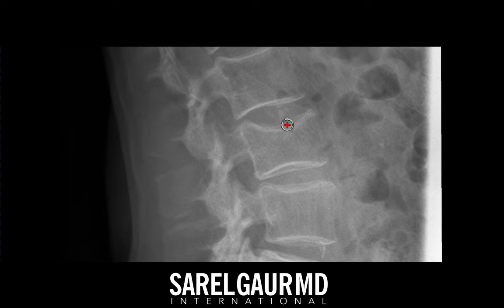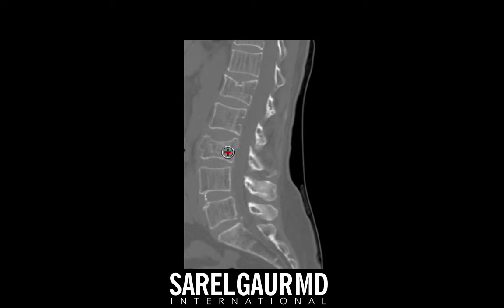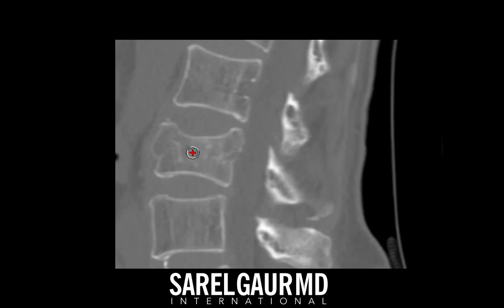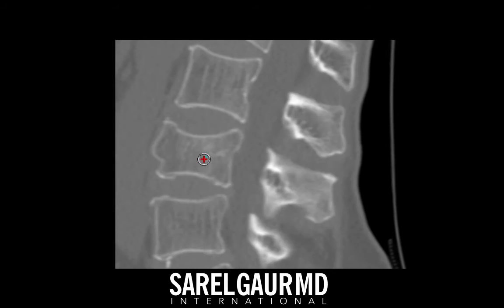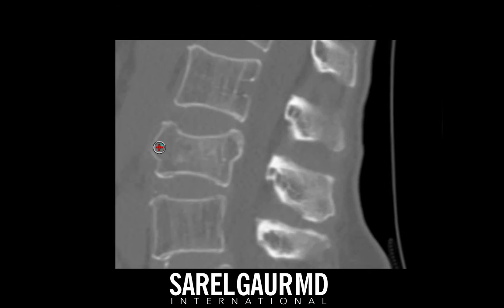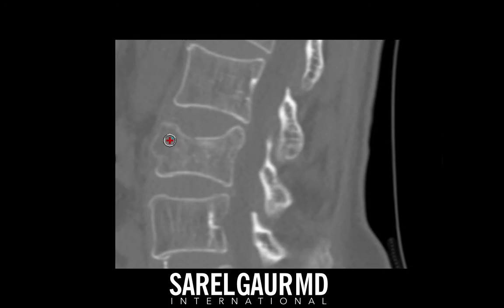The next step is to get a CT or MRI to confirm this finding. Now I have a CT of the lumbar spine in the sagittal plane. Looking at the L3 level, I'm seeing bulging of the anterior and posterior aspect of the vertebral body, so I'm definitely thinking about compression fracture here. Zooming in, I'm definitely seeing height loss. As I scroll back and forth, I'm seeing fracture line lucencies extending to the cortex — so there's definitely an acute fracture here.